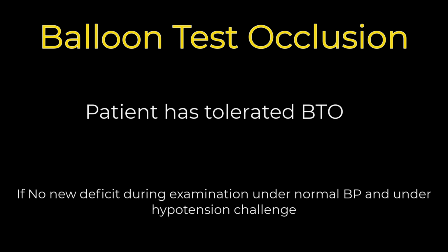We performed the occlusion of the carotid artery proximal to the aneurysmal segment, and we used 5 and 6 millimeter 3D shape coils. After deploying many coils, the check angiogram showed contrast stasis in the carotid artery. There is no antegrade flow. At the end of the coiling procedure, we decided to use concentrated glue. We used 50% glue to seal off the proximal end of the coil to totally occlude the carotid artery. This is the final angiogram.